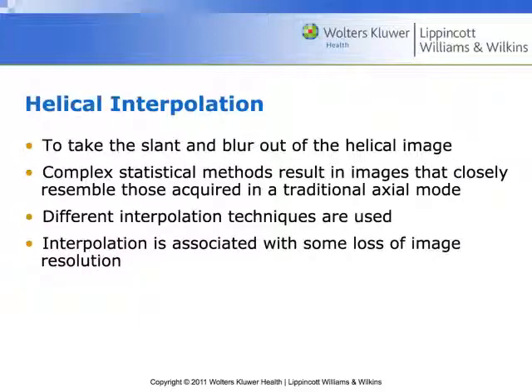The statistical analysis methods that we're using now in CT and the stuff that's being developed, and one of the things I'm working on for this article I'm writing, is that we are going back to the initial statistical analysis that we tried to use initially with CT, and we're reviewing that. We did not have the computing power to initiate it in the 1970s. We have the computing power to do it now.